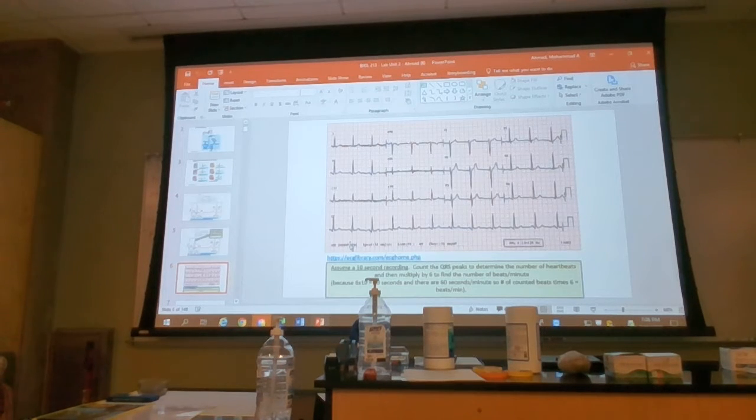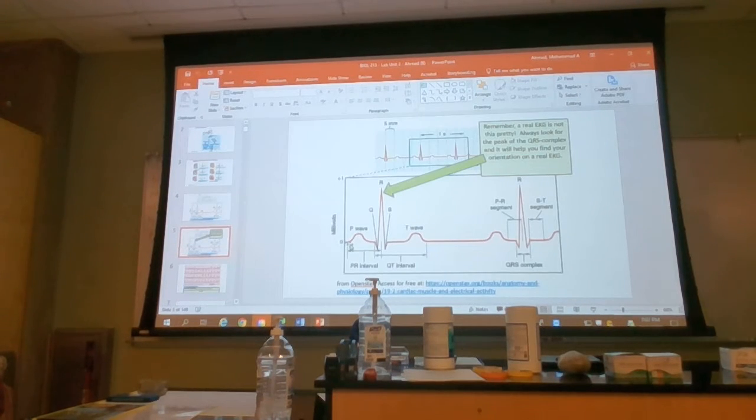So, good question. Generally, guys, the first wave you see on EKG is called the P wave. What is this? P wave, and this big second wave is called what? This is called the QRS, and then you see another wave. What is this wave? T wave. This T wave is telling us what? P wave is atrial depolarization. QRS is telling us ventricular depolarization. T wave is telling us what? Ventricular repolarization.